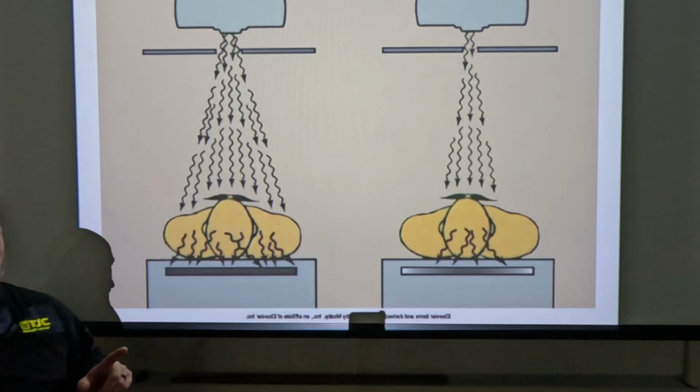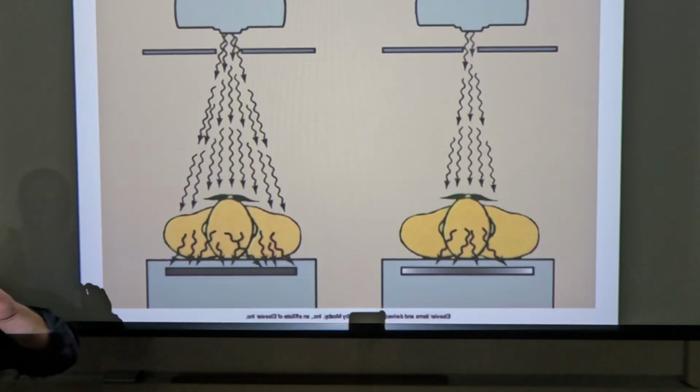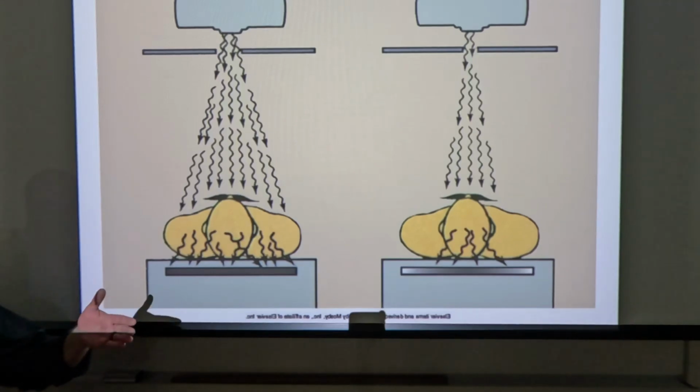Okay, and where you're going to have a kind of a struggle with this is that when the image comes up, you're going to make a leap from, well, if you actually collimated for a shoulder, down to shoulder size, well, we're focusing on the shoulder. Yes, you're focusing on the shoulder, but you didn't focus the x-ray beam. You blocked the x-ray beam from exposing other portions of the body.